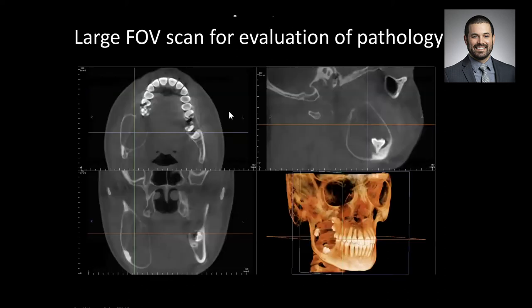This is a nice example of some pathology here with a large expansile lesion in the jaw. This was a cystic ameloblastoma. I like this case with respect to our prior talk last week, because I had a surgeon actually come to me after reviewing this case and say, hey, I saw this rendering and went in surgically expecting just to see this thin layer of bone left and get right at these teeth, but instead I ran into this layer of bone.